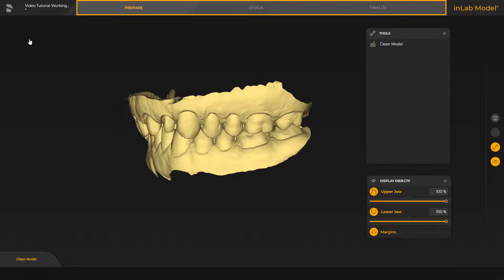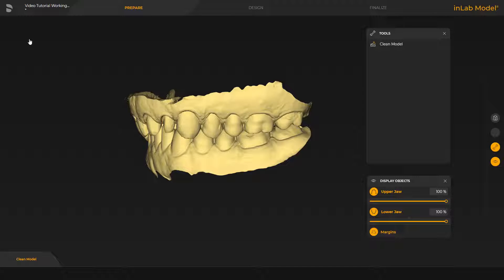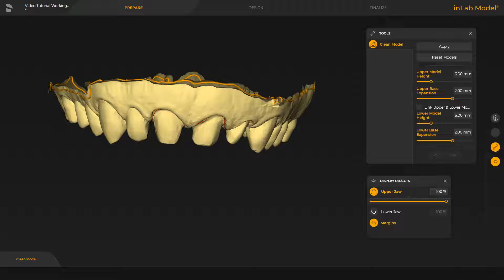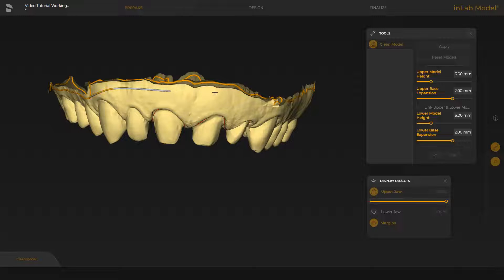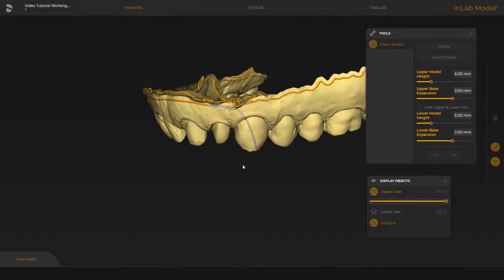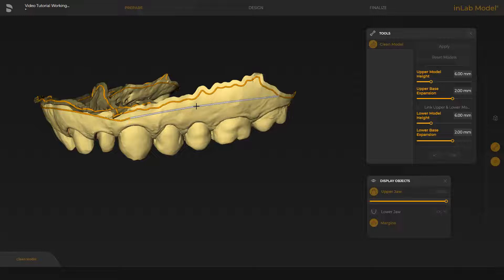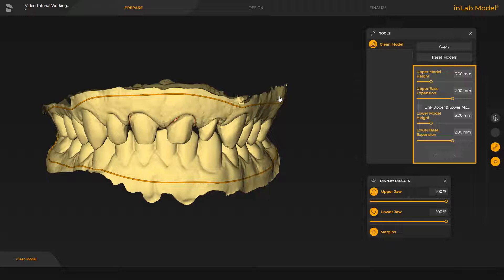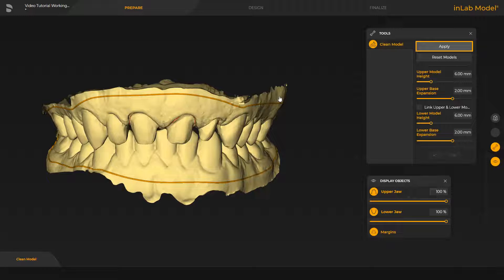In the Model App, there are three phases. We start out in the Prepare phase and are currently inside the Clean Model step. We enable the corresponding tool, disable the lower jaw, and begin with a double-click at any point of the line. We set further single-clicks until we finish the modification with a double-click on the line. We skip further corrections of both models, and next you are going to see the adjusted upper and lower jaws. At this point, in the window under Tools, different parameters can be determined in regard to the model base height and expansion. As soon as Apply is clicked, the base will be calculated.